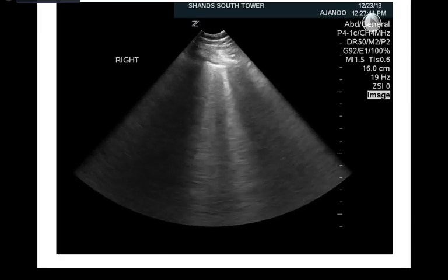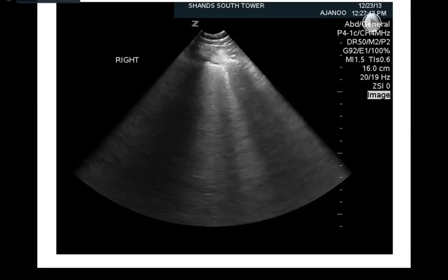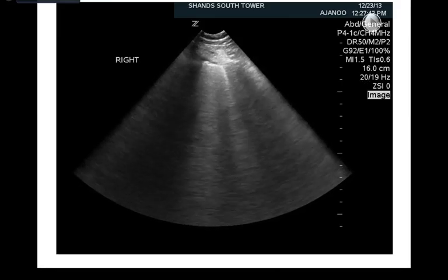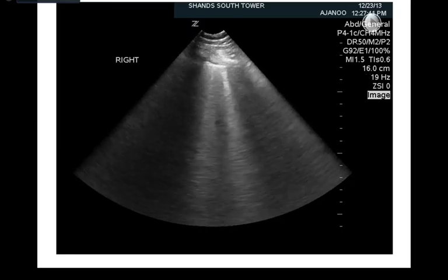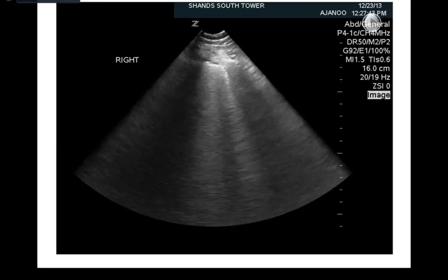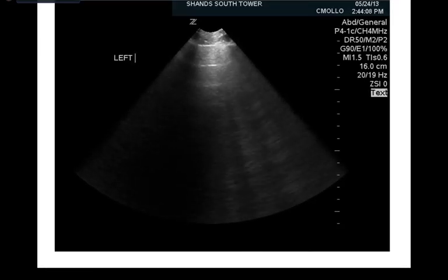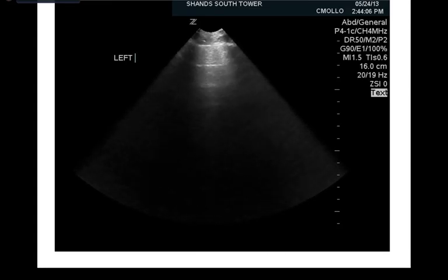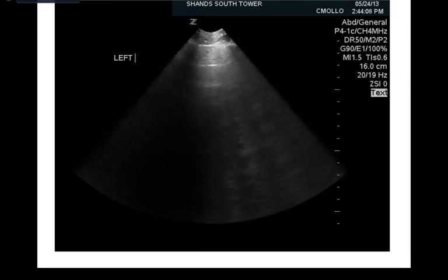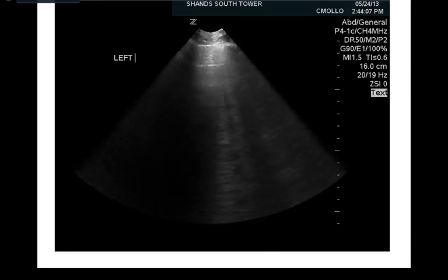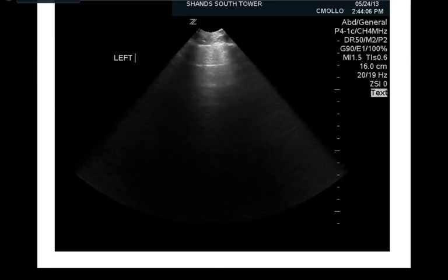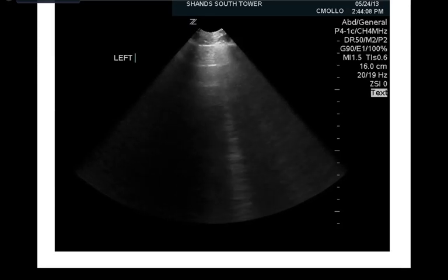Here are two comparison images: on the left, lung pleura with A lines and lung sliding; on the right, lung sliding with B lines. In another image, even though the depth is not ideal, you can see hyperechoic lines shooting from the pleura all the way to the bottom of the screen — those are B lines, not A lines. Here is another patient with B lines but in this case there is no lung sliding. If it is difficult to see, zooming in on the pleura confirms absence of lung sliding. Finally, there is an image showing both A lines and B lines: before the B lines appear you can see horizontal hyperechoic A lines, then at the end of the three-second clip some B lines appear.